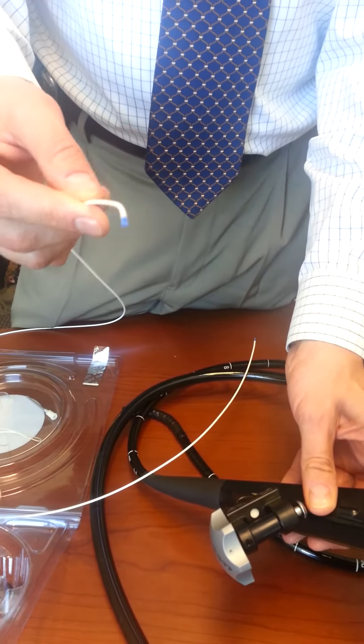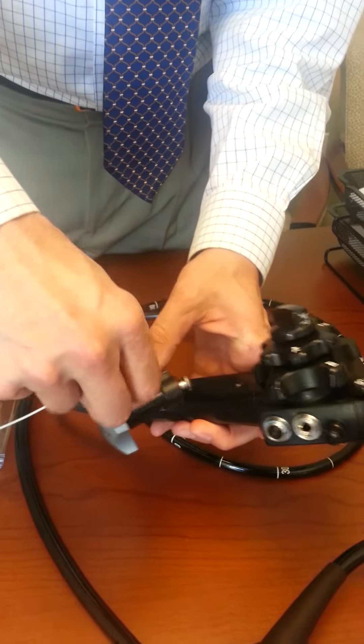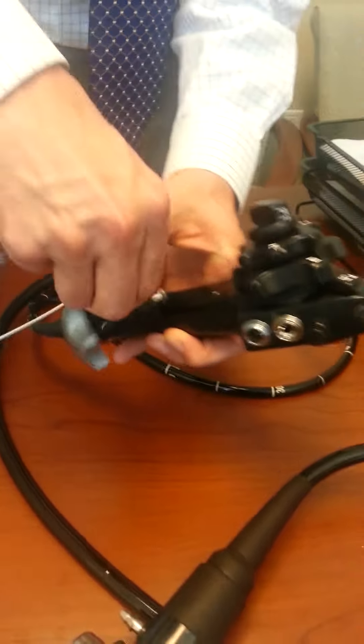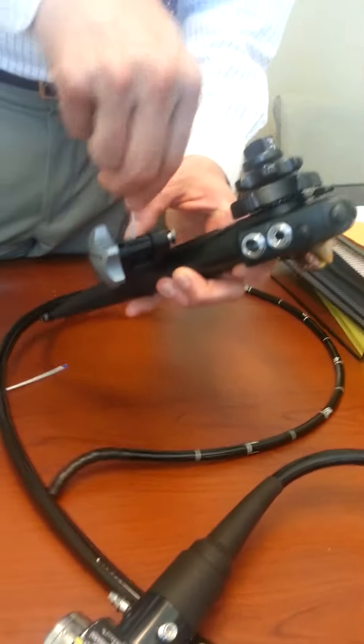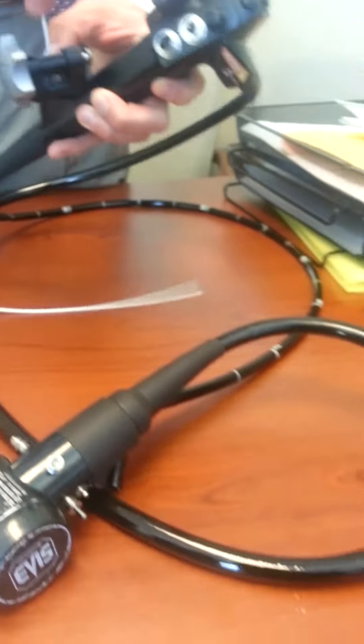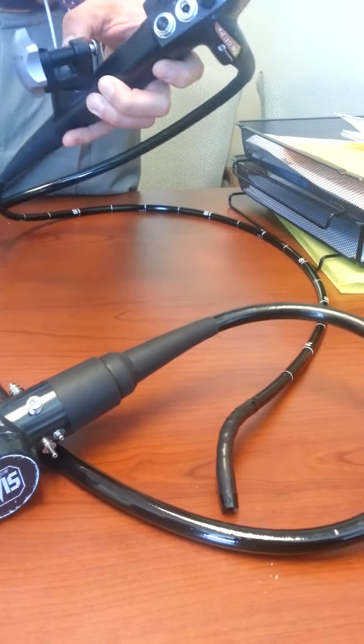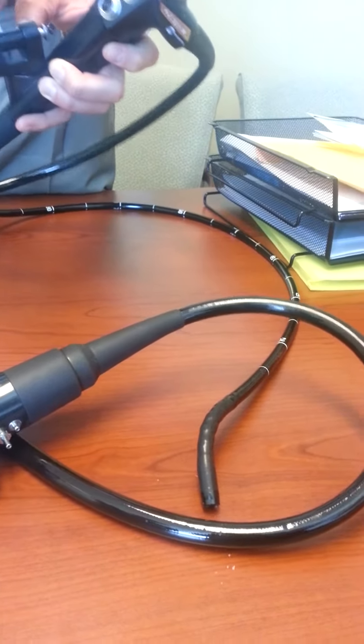Take the white cannula and put it through the diaphragm, all the way through the scope. It's going to come out the end of the scope and will be used to pull the string that holds the bander through the scope.